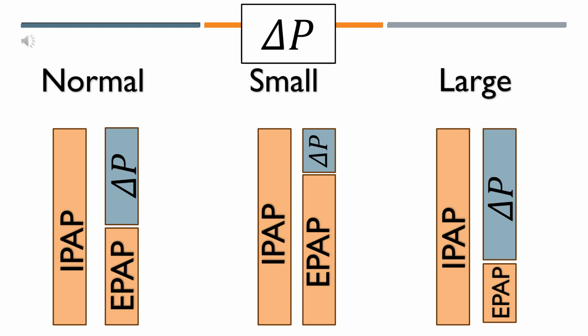So if expiratory pressure is adjusted and CO2 is within normal range, inspiratory pressure will need to be adjusted as well in order to keep delta P the same. If more ventilation is needed, IPAP can be increased and subsequently the change in pressure will increase, therefore increasing ventilation.